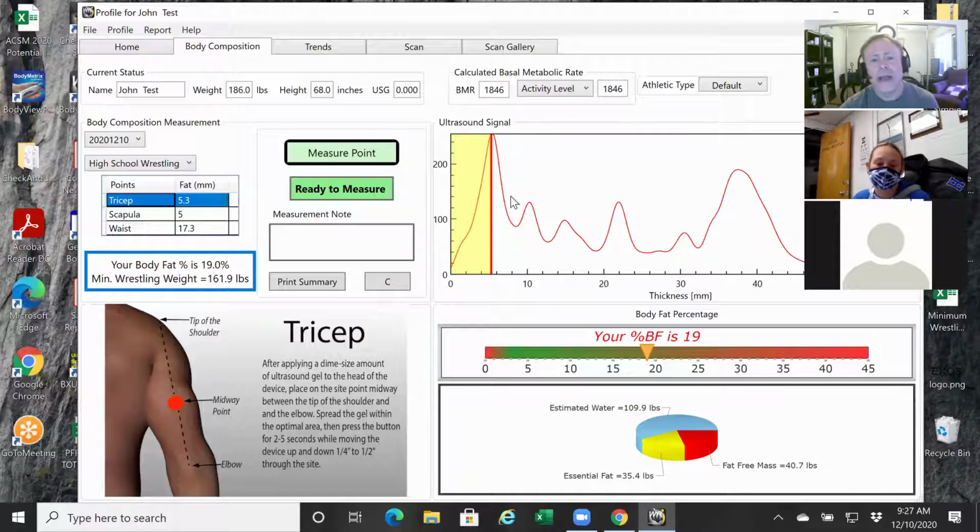So that's the fat muscle boundary, and that's really what you and I are looking for when we're analyzing this thing. Note that there's multiple peaks, kind of throughout the entire graph. The peaks, for your own info, they represent different changes or tissue boundaries. This one here is probably fascia, perhaps, could be a vein structure and so forth. This last one is a reflection off of the bone. We know that because we see the signal just kind of die off, tail off.